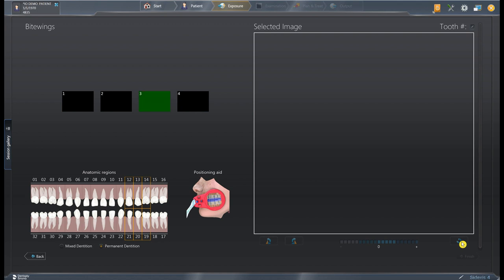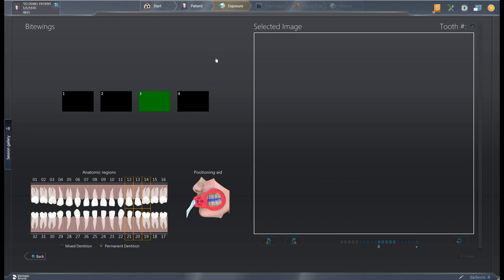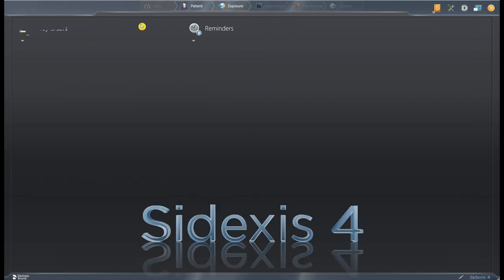So let's imagine we just took four images — we would then click Finish down here and it would move us into the light box. I'm going to show a different way to move into the light box since we're not live acquiring, and that will take us back to our start menu first.